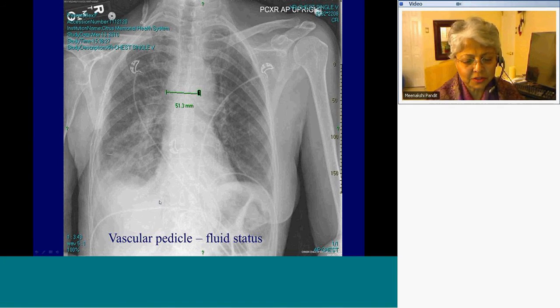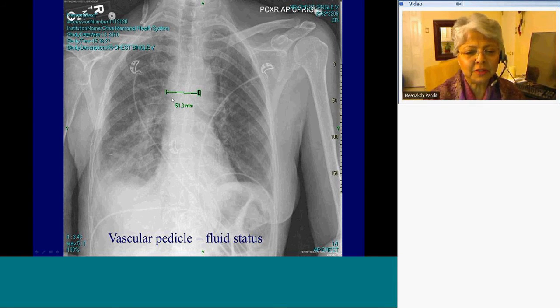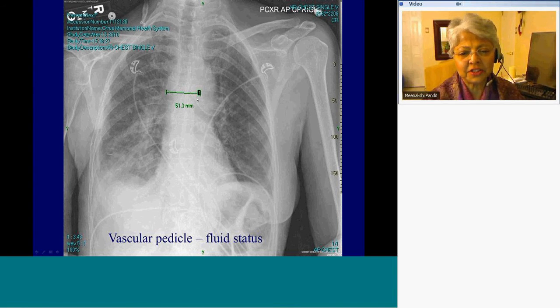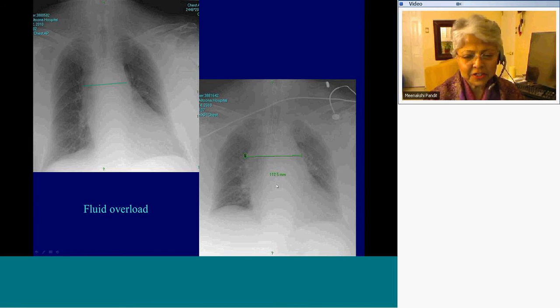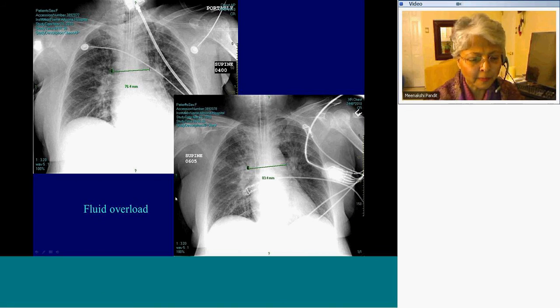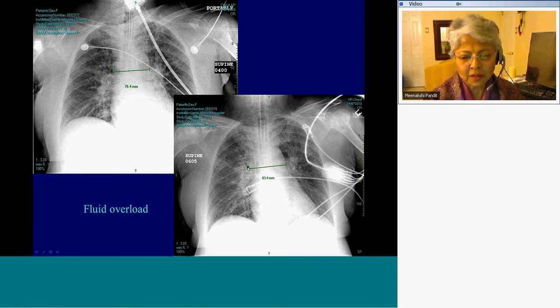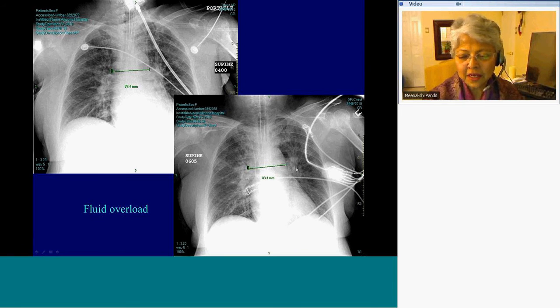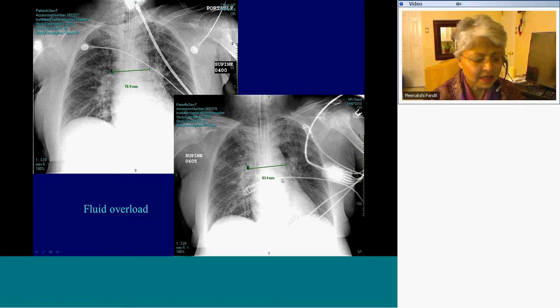As intensive care radiologists, we should always keep track of the patient's fluid status by assessing the vascular pedicle, which is a composite of venous and arterial structures emanating from the heart. Even by eyeballing, we know that this vascular pedicle is much wider than normal — the patient's lung volumes are lower and there is hilar haziness, caused by fluid overload. Another patient also had fluid overload; the vascular pedicle is almost a centimeter wider, causing pulmonary edema and increasing reticulonodular opacities. We also appreciate fluid overload by comparing the end-on bronchus with the end-on pulmonary artery — it's almost twice the diameter.